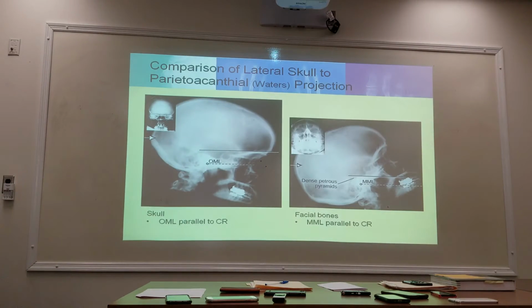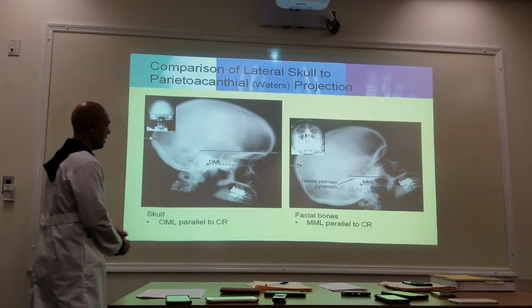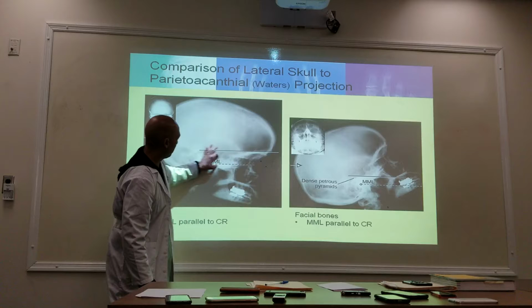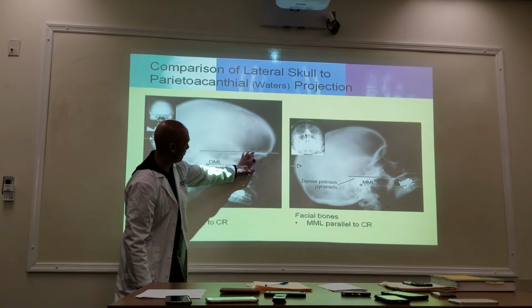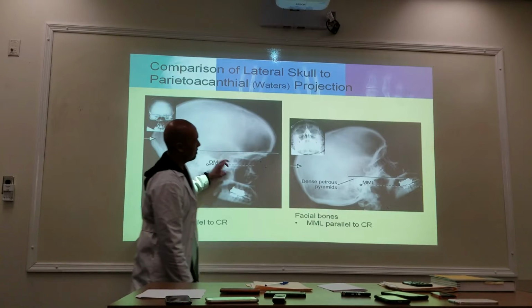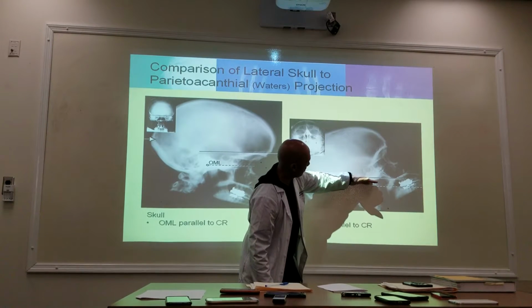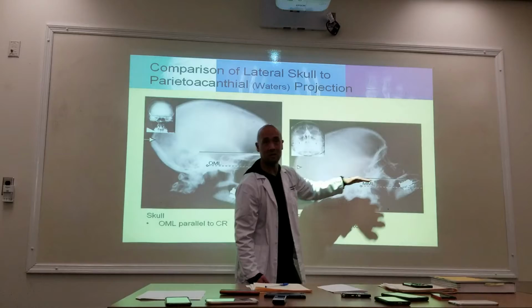So here is an example of what we were just talking about. In the PA 0 degrees, the petrous ridges, which is right here, or the portion, is going to fill up your orbits. With an extension, look what happens. It's still the same level here, but with a chin extension, it brings it below the maxillary sinuses.